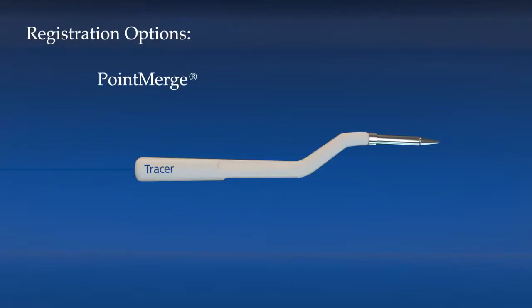Point merge registration requires the user to pre-define landmarks on the patient scan and touch them in the same order on the patient.